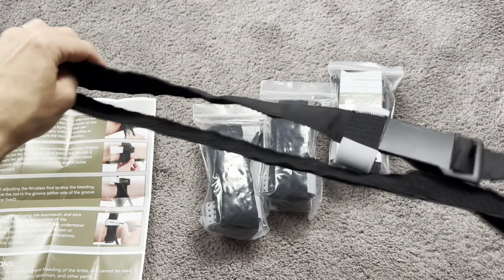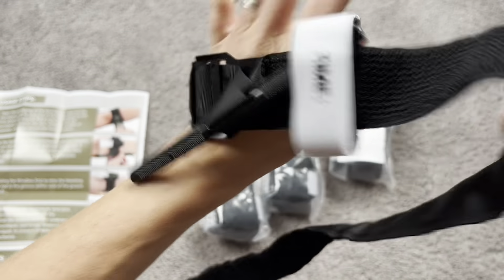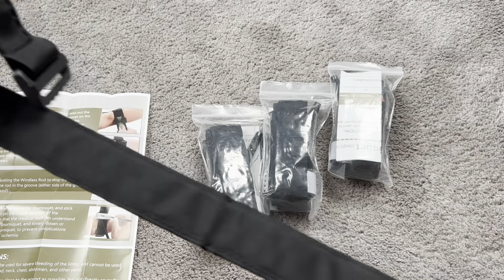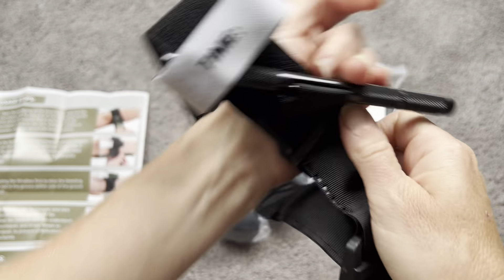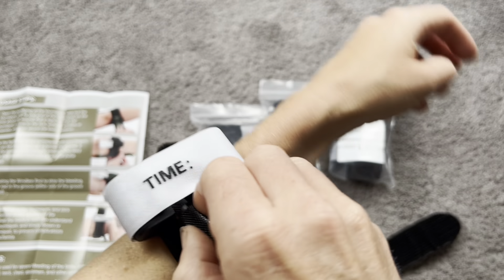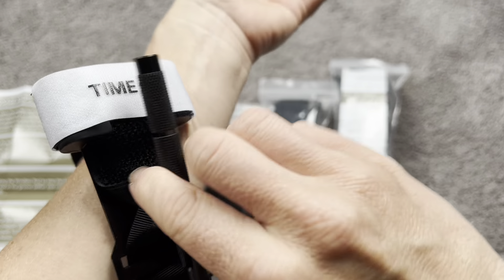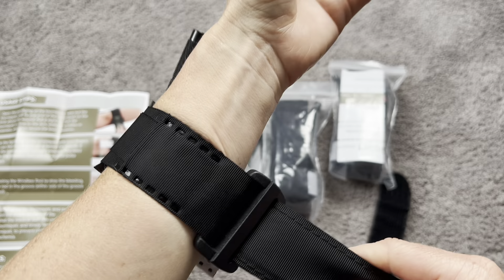I'm going to go ahead and try it out. I don't have a major wound, but these are designed to get really tight and I'm just going to show you exactly how it works. Say I had a cut or an abrasion that needed the bleeding to stop — you're just going to put this strap through just like that, tighten it as much as possible, and then velcro it in place. Then you're going to take this wand, which I really like because it makes you able to get it even tighter than the teeth and velcro alone.